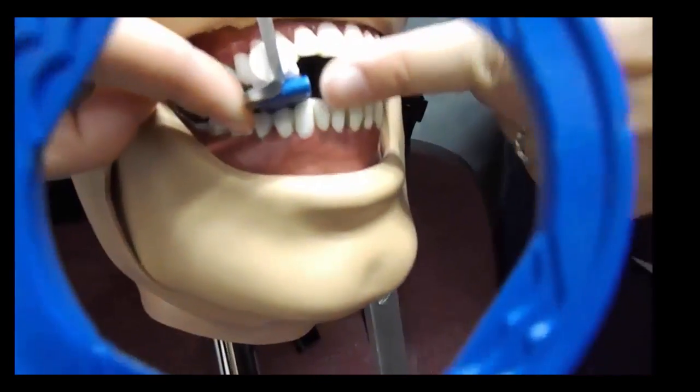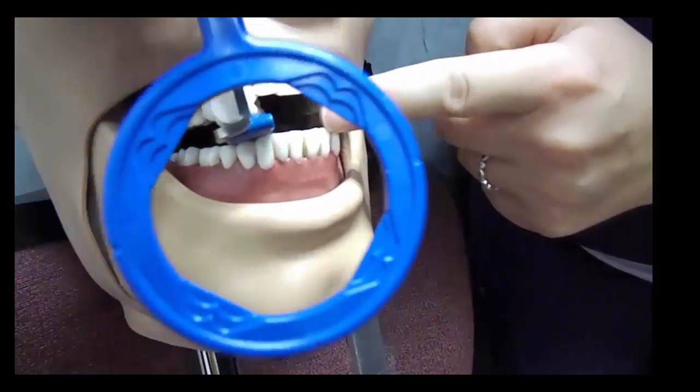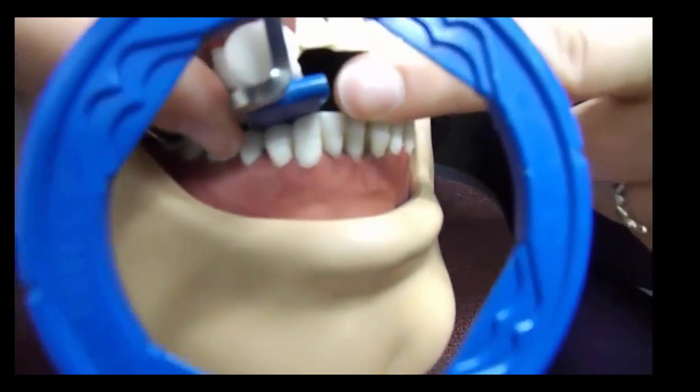Again, look through your ring, checking to make sure that the first premolar and canine fall from the outside of the metal bar to the outside of the blue bite block.